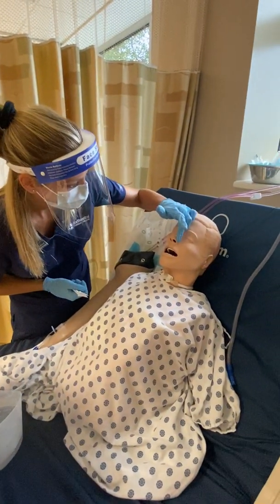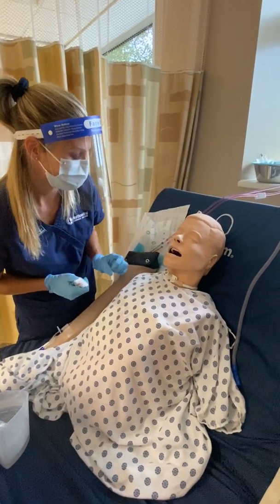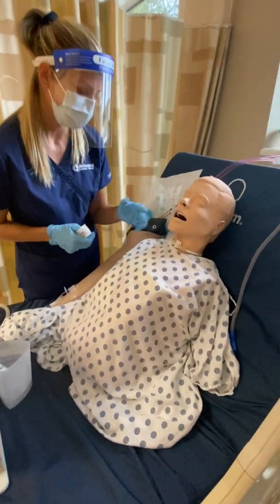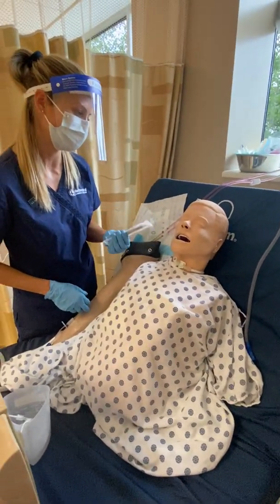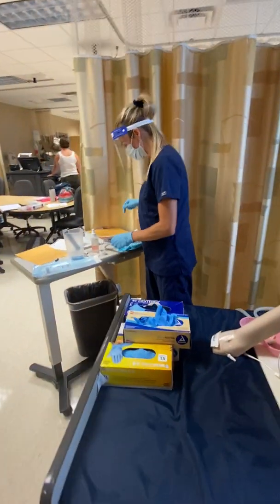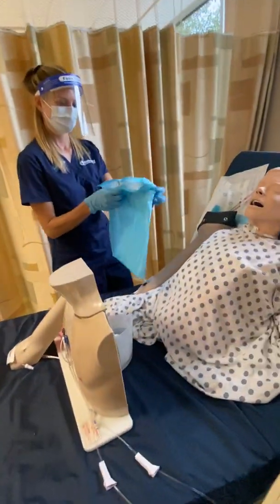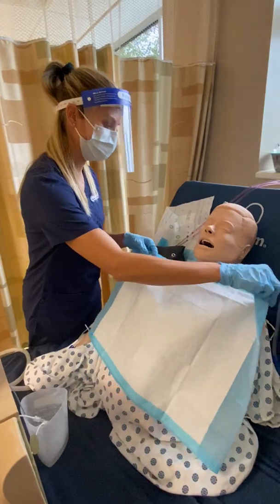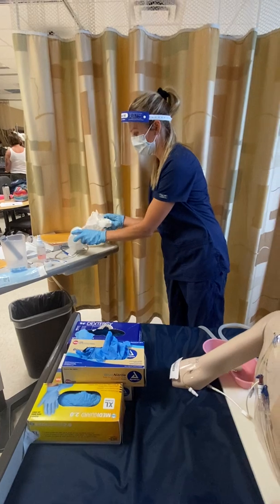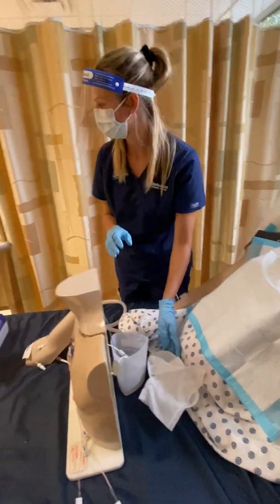So I'm going to occlude your nostril, and can you breathe for me through the nostrils? And then is there one that you're able to breathe through better? And she says that either one is fine. So I'm going to go through her right nostril, because it'll be easier for me and closest to me. Okay, all right. So I'm going to get a couple supplies here. I'm going to put this right here in case you feel like you need to cough or anything. And then I'll give you this in case you're feeling nauseous, and some Kleenex.